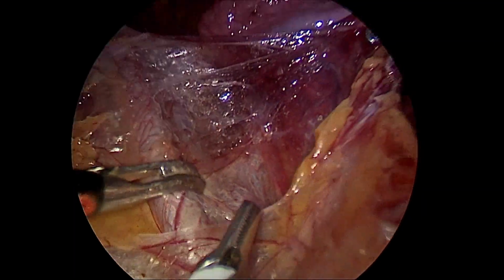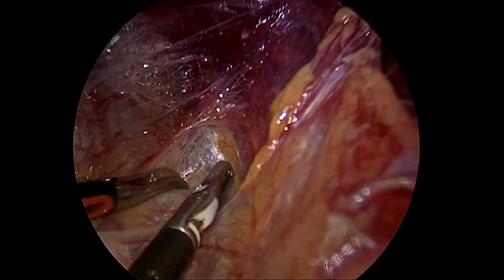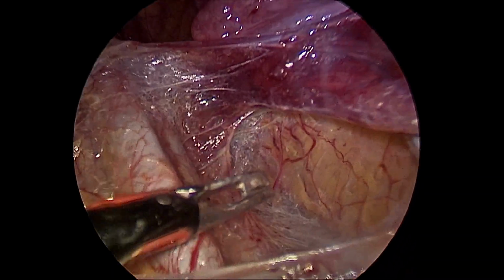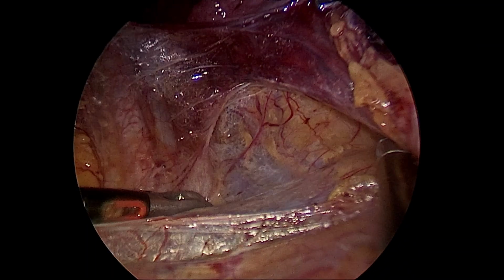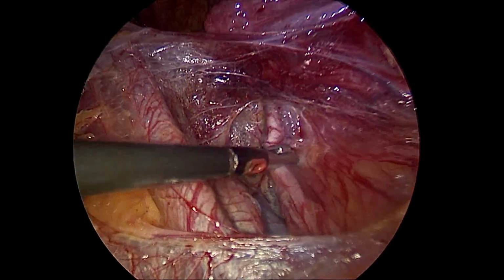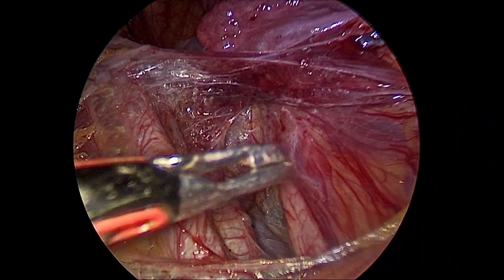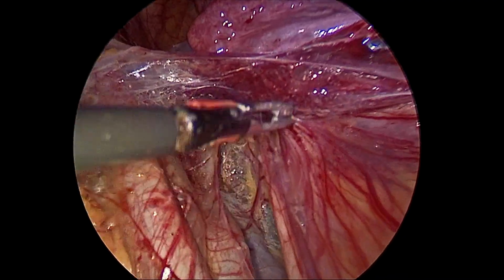Whenever we are doing the dissection, we will find that there is a layer of peritoneal tissue on the top which covers it. Once that is removed, we are entering into the broad ligament spaces, the lateral pelvic wall spaces. Here with simple dissection, as you can see, it's a completely avascular plane, and there, that's our friend the ureter. We will now be dissecting the ureter from the lateral pelvic wall so that when we go to the left ovary, we have the ureter mapped out and we do not have any surprises.